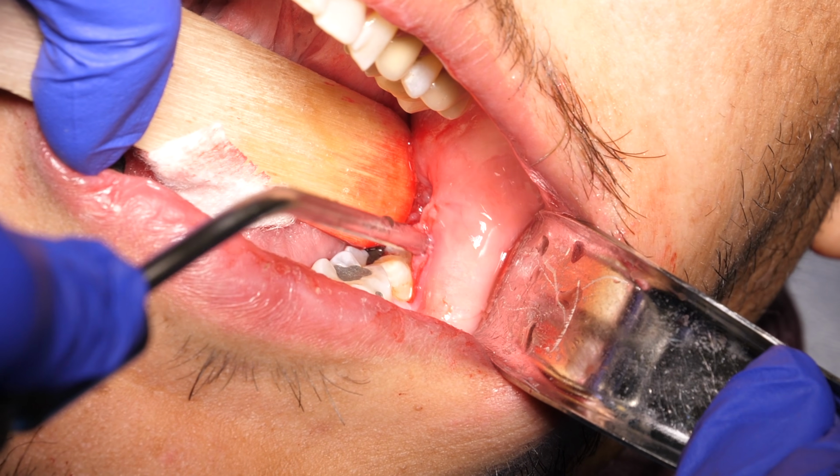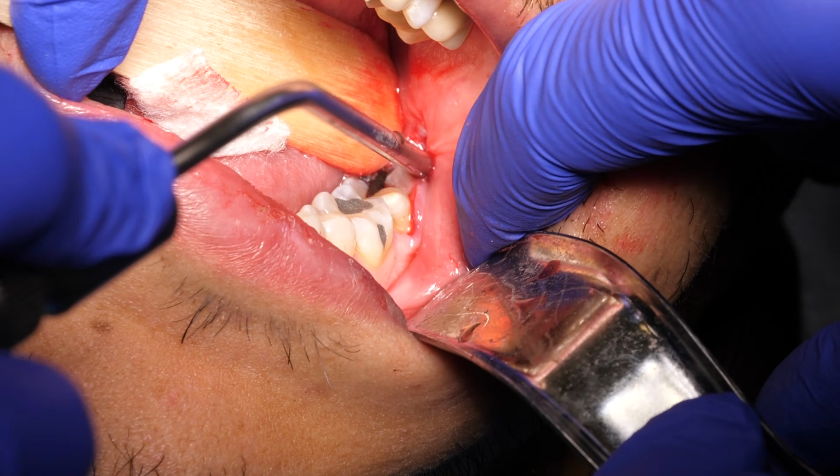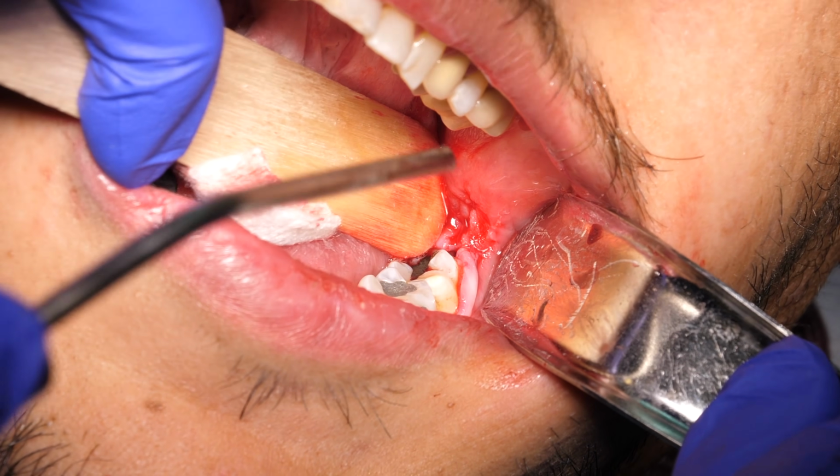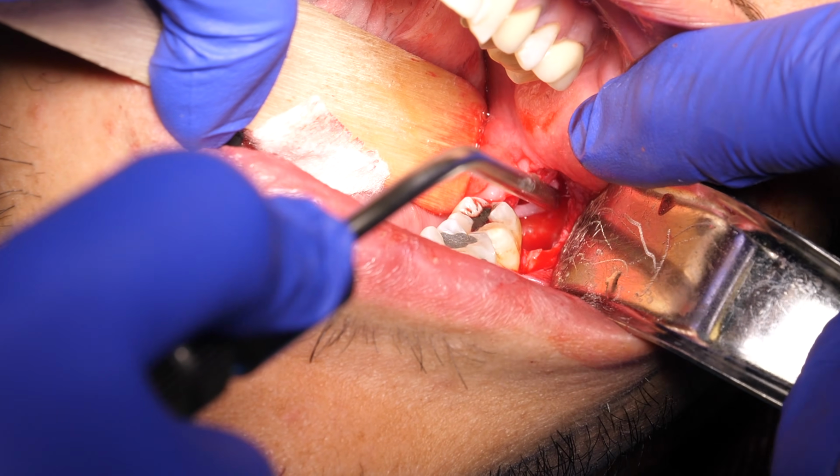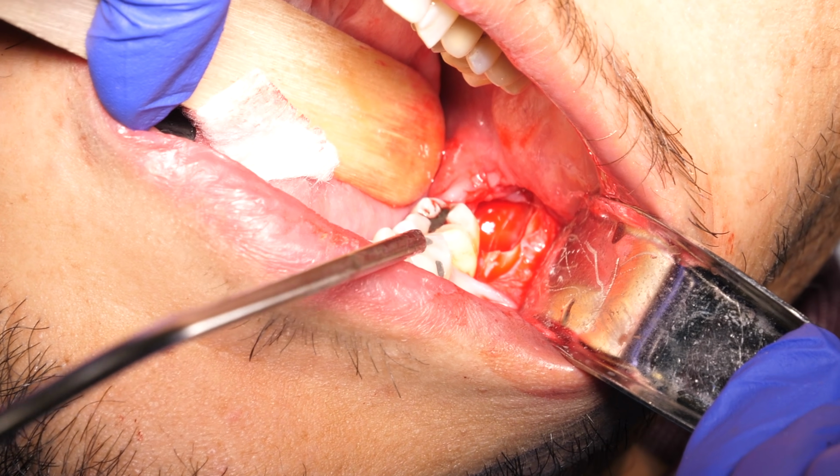No footage was obtained for the placement of suture. With that said, a 3-0 chromic gut was placed to ensure hemostasis and proper healing of the extraction socket. The placement of the suture will depend on the type of incision.